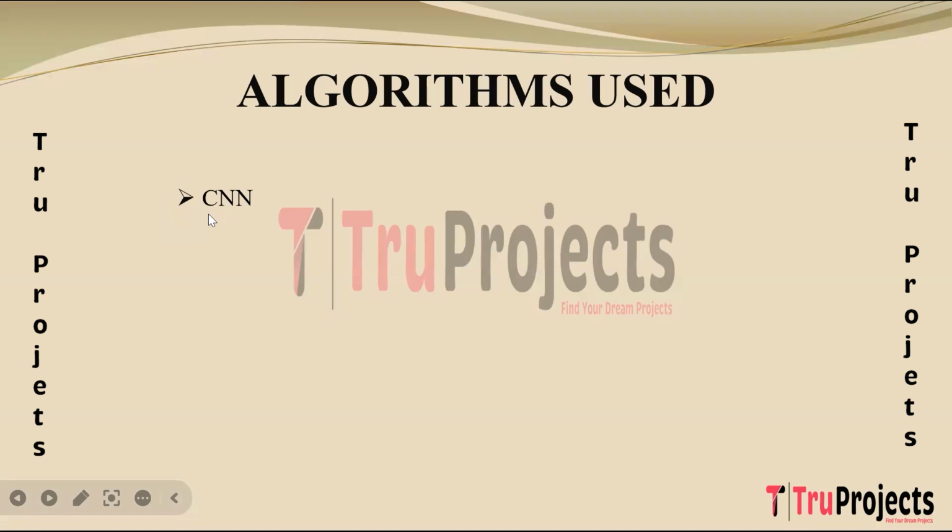The first algorithm is CNN, Convolutional Neural Network. CNN is a class of neural networks primarily used for image related tasks due to its ability to effectively learn hierarchical representations of features. It comprises layers like convolutional, pooling, and fully connected layers. Convolutional layers extract features by convolving learned filters across input images to capture spatial patterns. Pooling layers reduce spatial dimensions, and fully connected layers perform classification based on extracted features. In the context of the project, CNN forms the basis or a component of the model architecture. It aids in feature extraction from the knee X-ray images, enabling the model to identify intricate patterns associated with knee osteoarthritis.